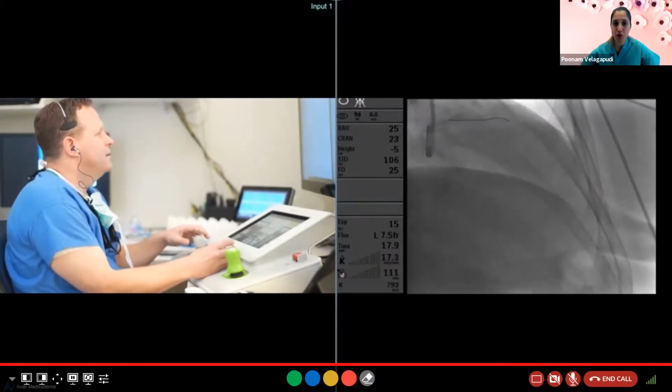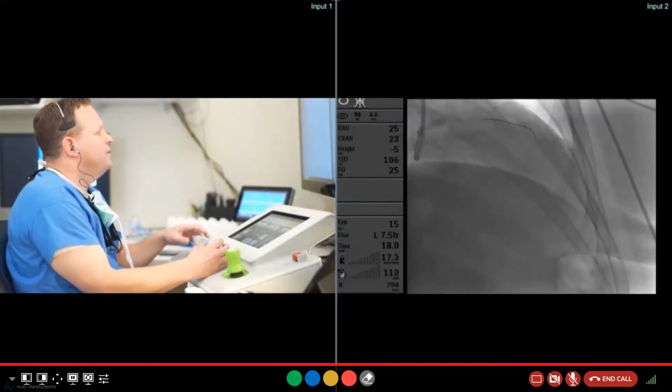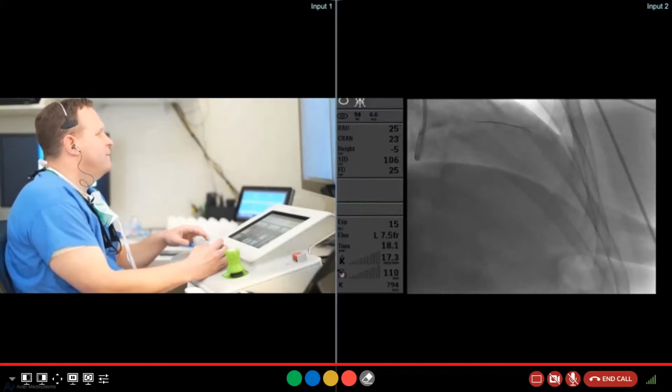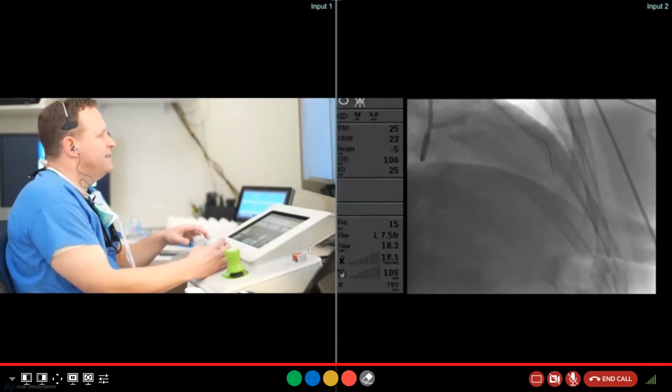Curious, are you able to use the roadmap with the system, Dr. Harvey? We do sometimes. Actually, we're upgrading this room. Give a puff there, Sam. We do, truthfully, in one of our other labs that doesn't have the robot. This lab is an excellent lab, but it's end of life, and so we're upgrading it to a lab that will give us the roadmap. Give a quick puff there one more time, Sam.